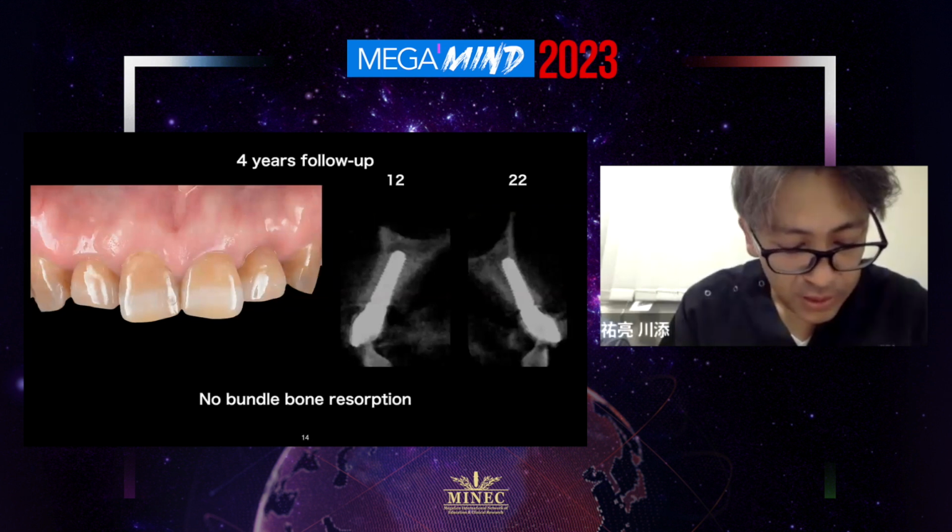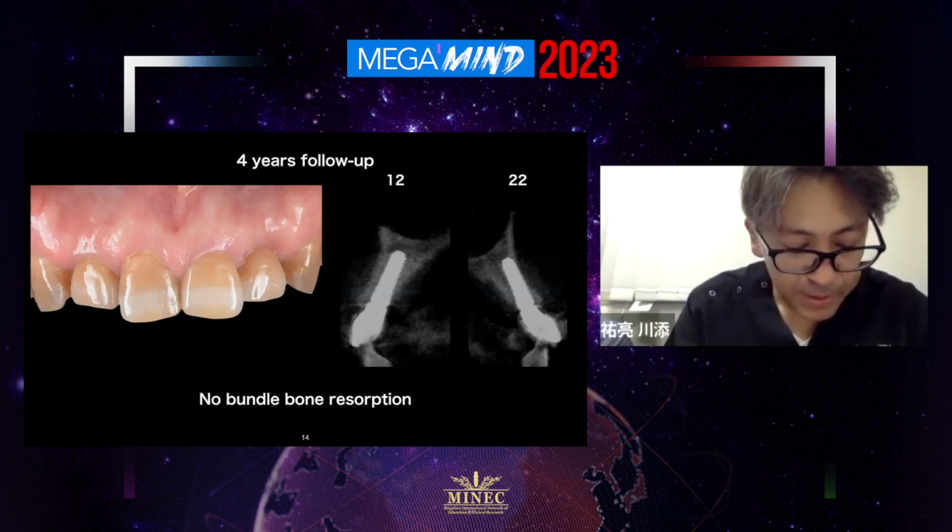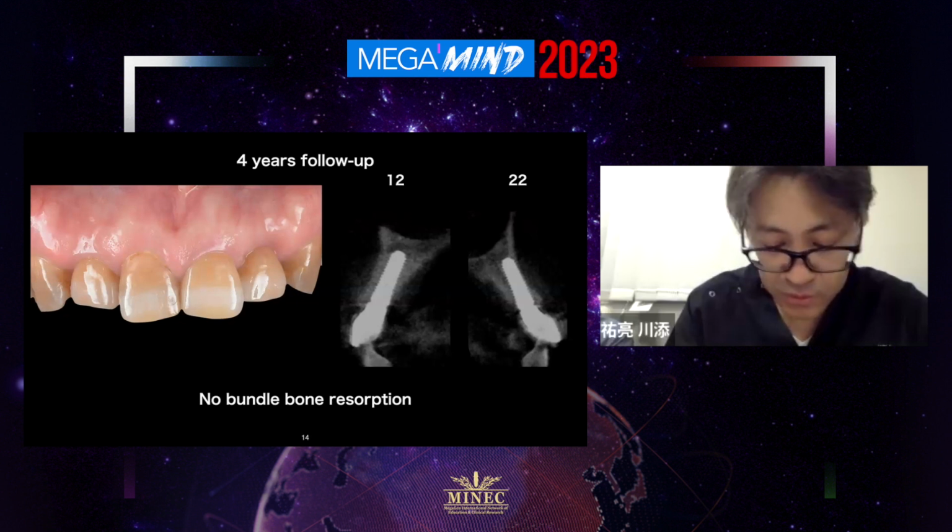This is a picture taken 4 years post-operatively. Tooth 12 shows that there is no alveolar bone resorption on the labial side.